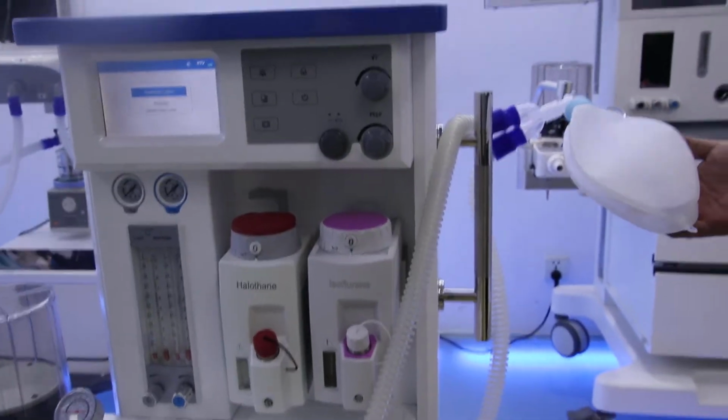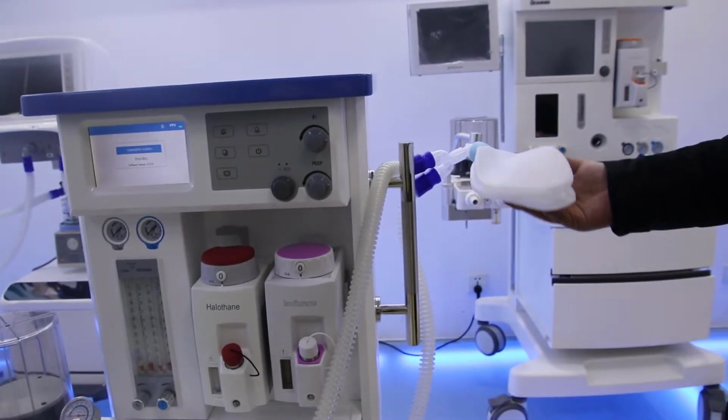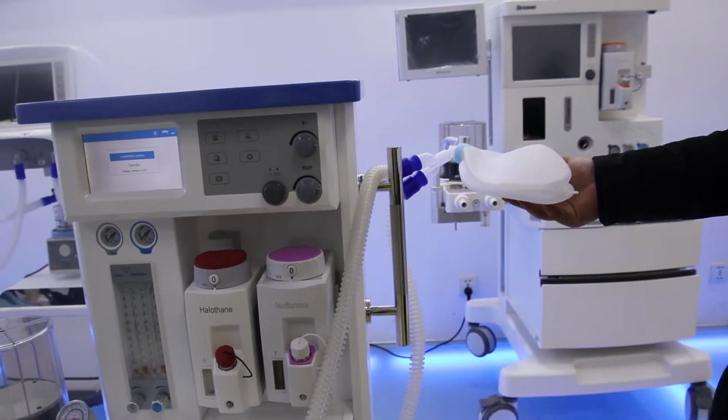Here is the bag. For the breathing bag, we have totally 4 types: 0.5 liters, 1 liter, 2 liters, and 3 liters. Usually for a baby, we use the 0.5 liters, and for an adult, we use the 2 liters or 3 liters.